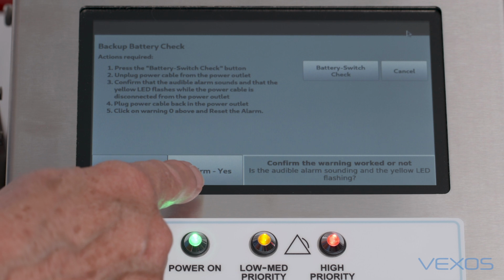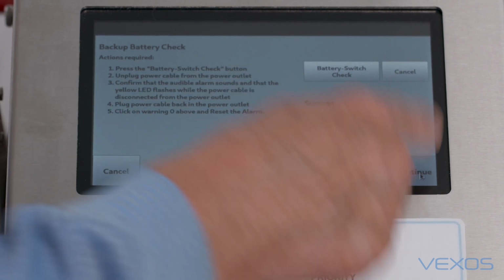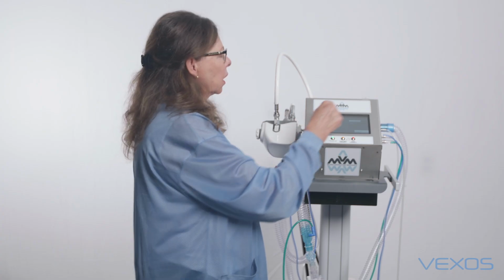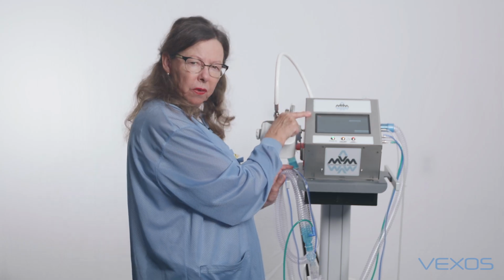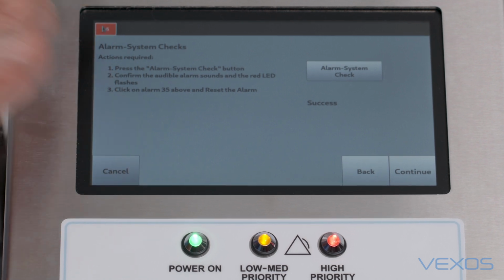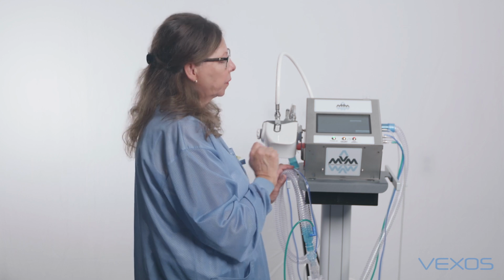On to the next test, which is the alarm system checks, simply making sure that I can hear and see alarms. I touch this button. Yes, I will confirm that I see it and hear it by confirming here. I'll also notice there's another square that has opened here with a number on it. I'm going to open this and it says test alarm. I'll confirm and that disappears. We're now finished with the self-tests.